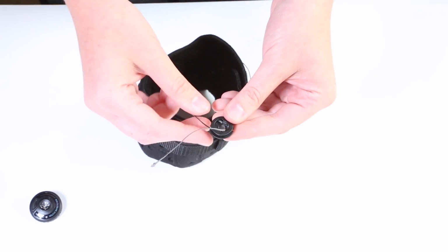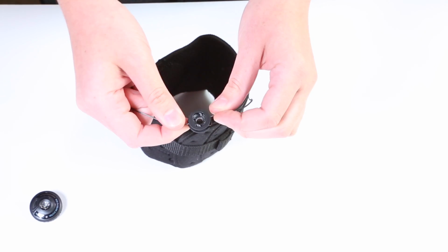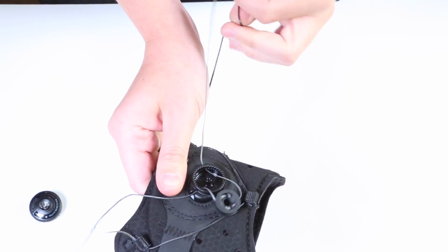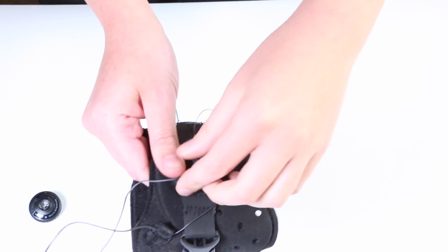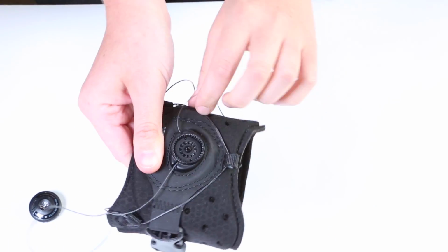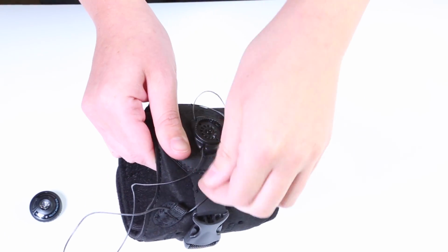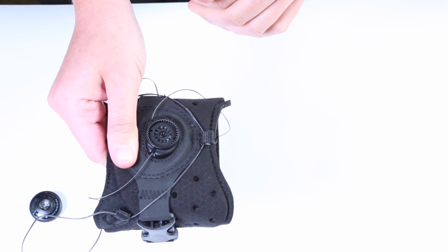After we've tied our knots off as close to the end as possible, we'll just pull them tight against that spool and then just thread our cord. Now we're just gonna take our cord, thread it back through and insert that spool into the center. And I like to just do it with all of the cord out, not any cord on the inside, just so we make sure that it wraps around that spool properly.